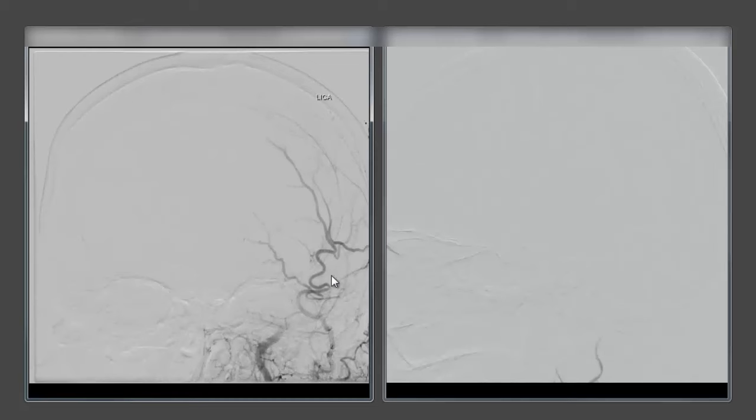This is again injecting dye into the common carotid and we're opacifying in the normal situation both the external and the internal carotid artery but what you're going to see here as we move forward in time we only see branches of the external carotid artery supplying these scalp branches and branches to the face and it's very hard to see any flow straight into the brain through the internal carotid artery. If we follow it out farther in time as the contrast is making it farther down the line in the scalp branches we start to see this shadow here that is the internal carotid artery so contrast is very slowly making it up towards the site of that occlusion through some side channels perhaps through an ophthalmic artery that's not covered by the clot allowing some slow passage of contrast with sufficient time.